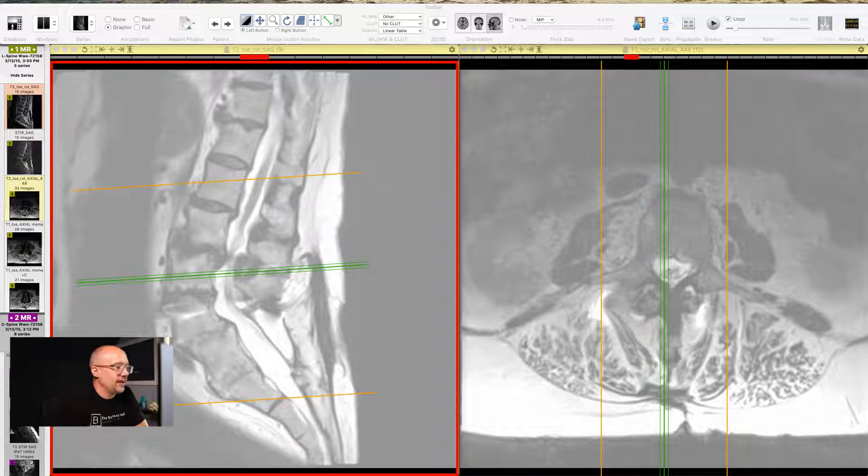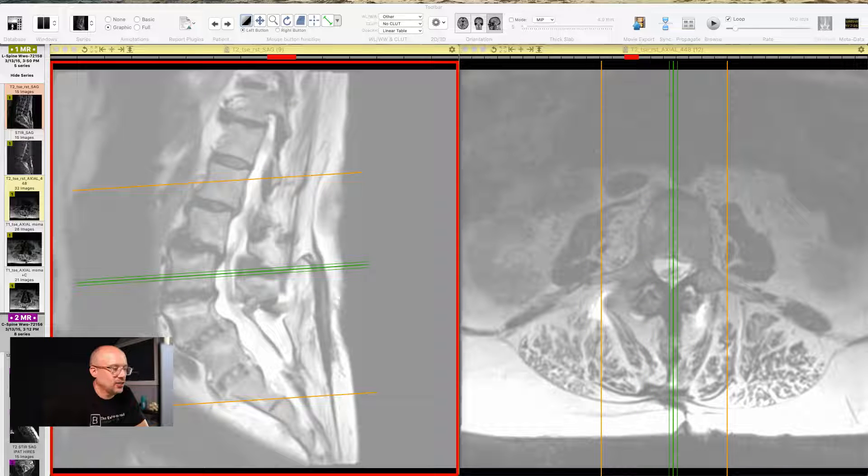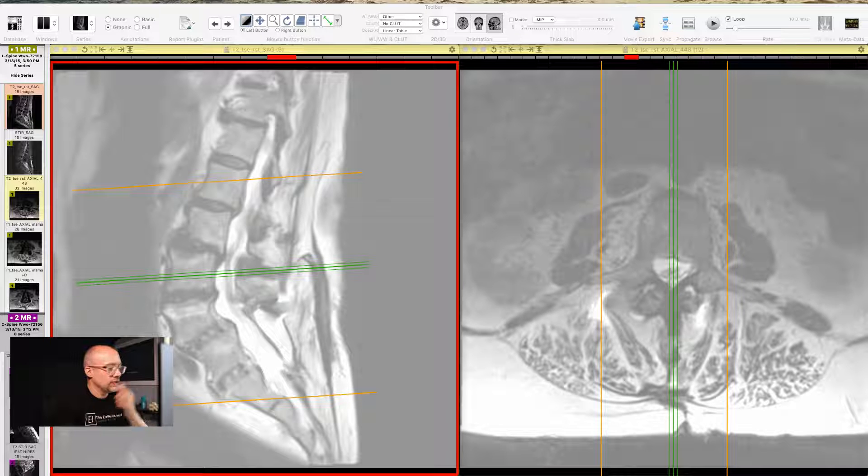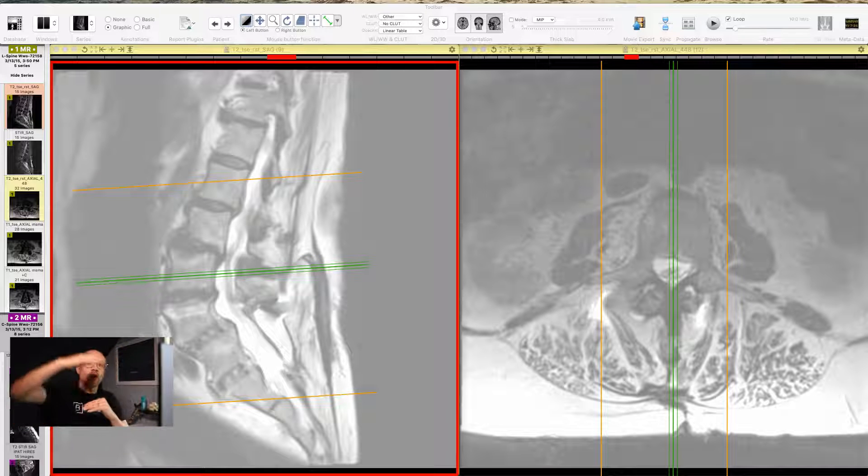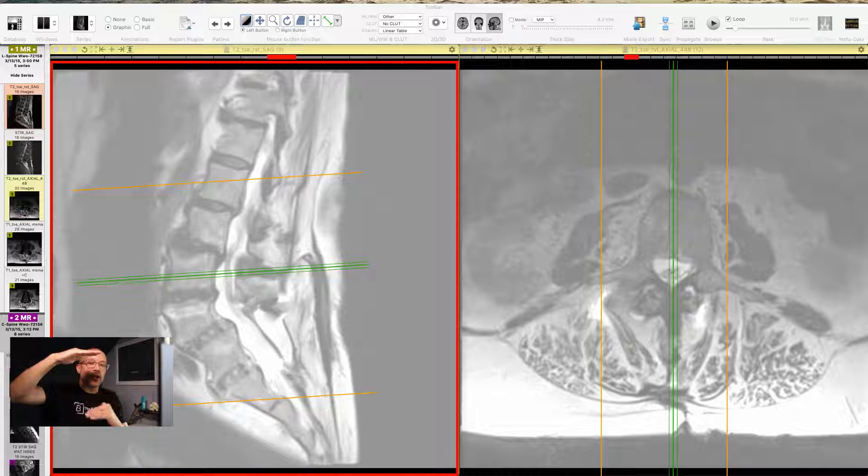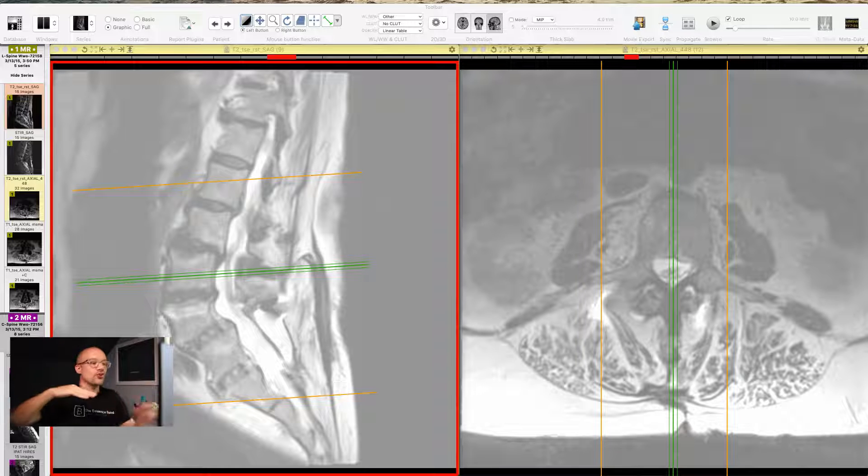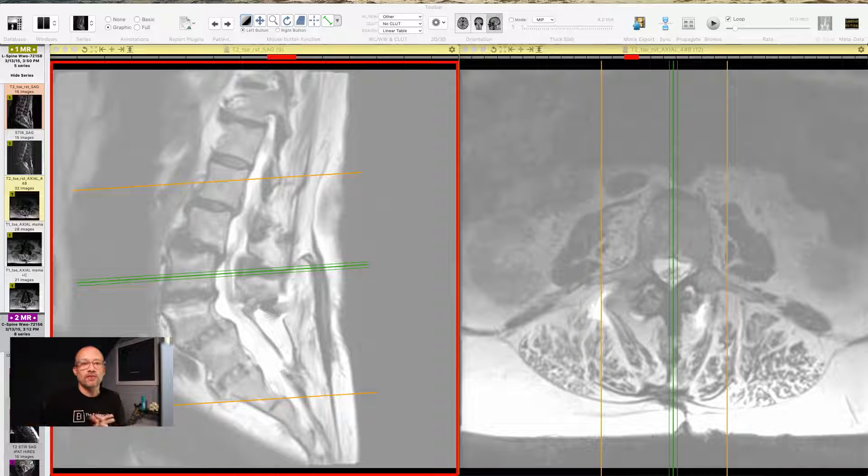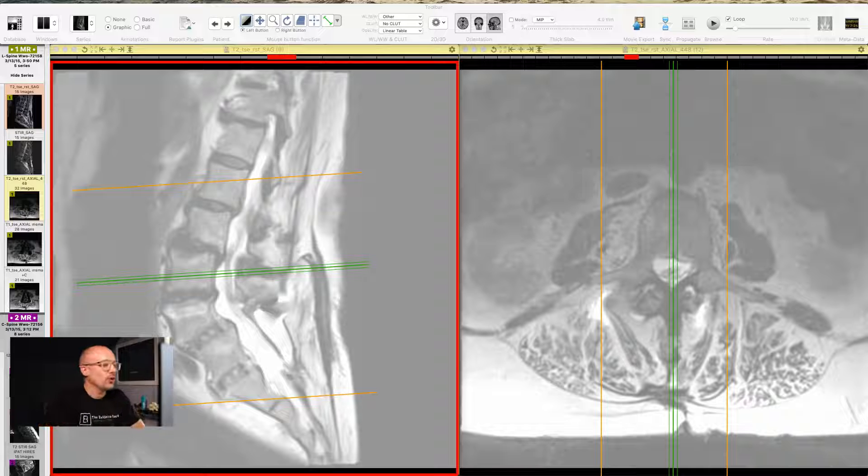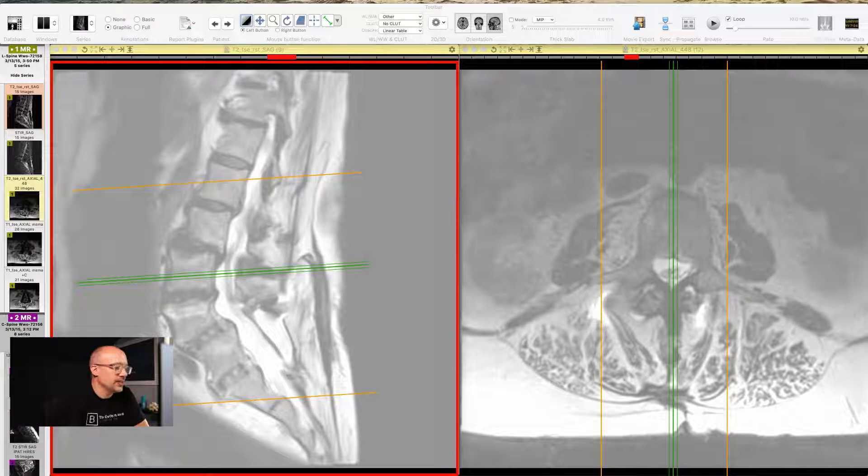I'm going to start on the left-hand side of the screen. The yellow lines on your screen are showing you exactly how far up and how far down the scan goes. And the green line is what we refer to as the scout line. It showcases to you where you are in space.